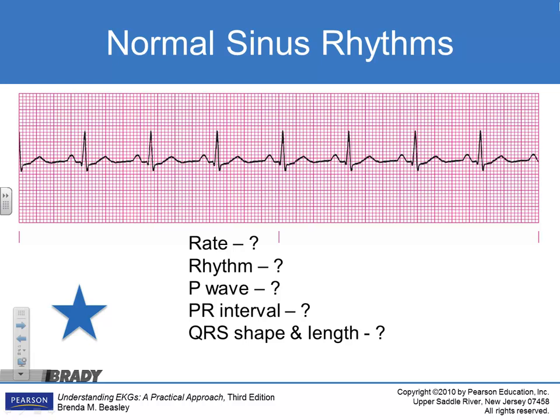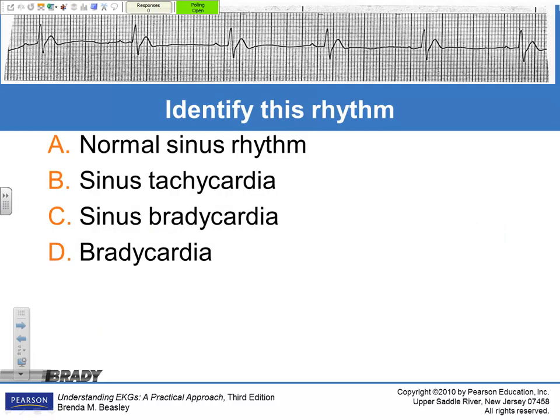Yeah, I think so. All right, let's see what our question is. Identify this rhythm. Go through the 5 steps.